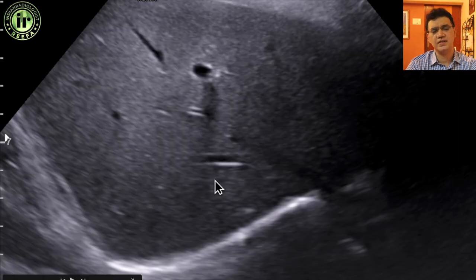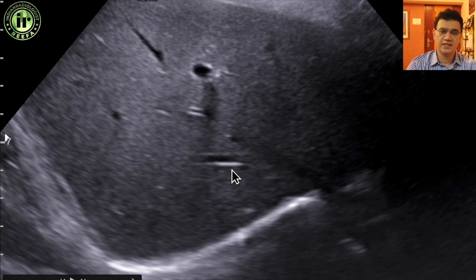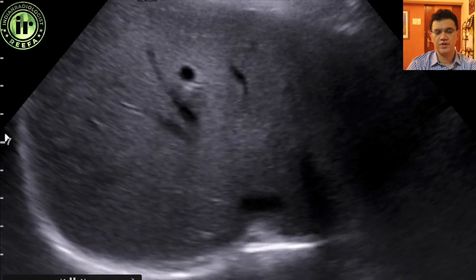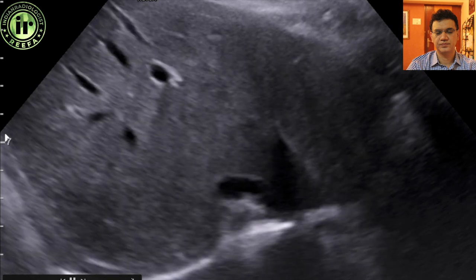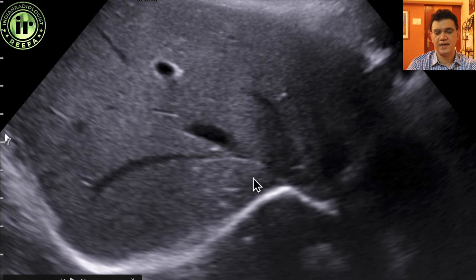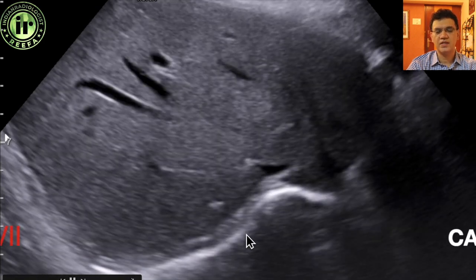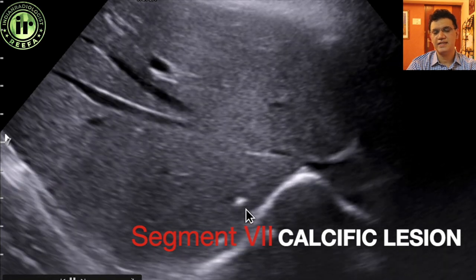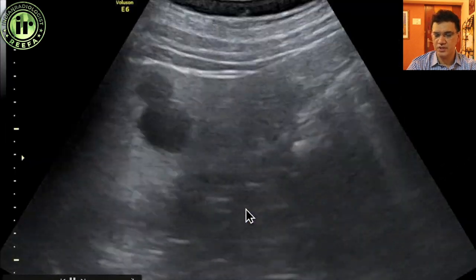Let's understand this by looking at some common cases from day-to-day practice. In the right lobe of the liver, we can identify the right branch and middle branch of the hepatic vein. Anything to the right of the right branch of the hepatic vein will be in segment 7. What we are seeing here is a small granulomatous or calcified lesion in segment 7 — a benign, leave-alone lesion.